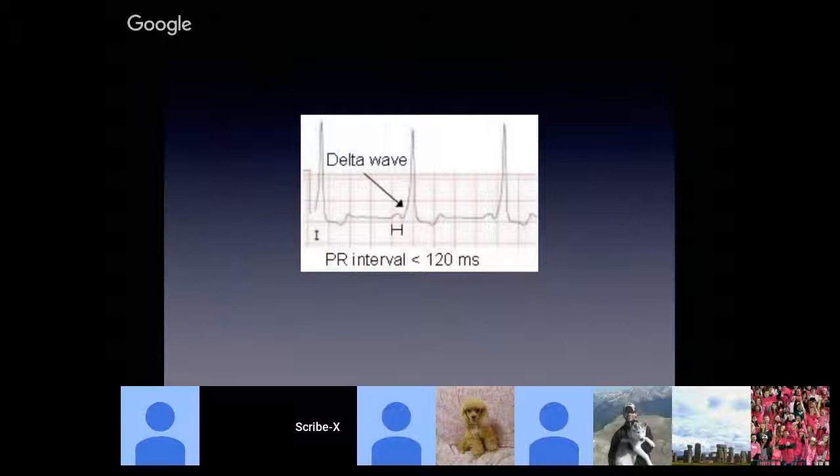But then you see here this kind of slurring of this R wave. Normally, an R wave will be very linear, sort of a slanted linear pattern. It usually doesn't curve like this. So what could cause this? It's almost as though after the P wave is generated and the atria contract, the AV node is letting signal go down through the Purkinje fibers to the ventricles too early.